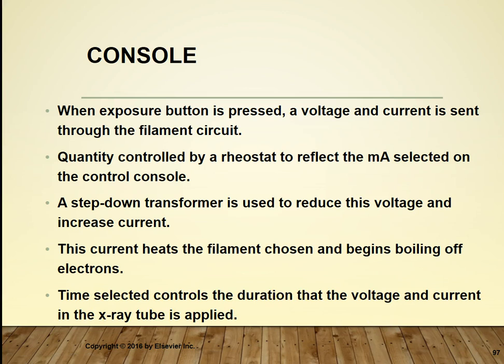That's a lot of work, but the time selected by you controls the duration, and then that's described when we talked about either the synchronous timer or the electronic timer, which are then basically broken down into your exposure factors.